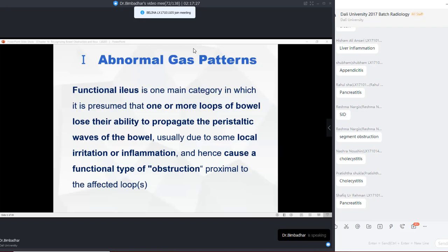So you are going to proceed with a CT scan, right? In pancreatitis, you are going to look for pancreatic exudative inflammation, right? And in cholecystitis, you are going to look for an enlarged gallbladder and exudative inflammation around the gallbladder, okay? Increased size of the gallbladder and surrounding fat stranding along the gallbladder will give you the radiographic features of cholecystitis. A positive Murphy sign can indicate cholecystitis, and it might also be related to non-obstructive jaundice, right? Okay, so that's the reason we are going to further investigate this patient with a CT scan.